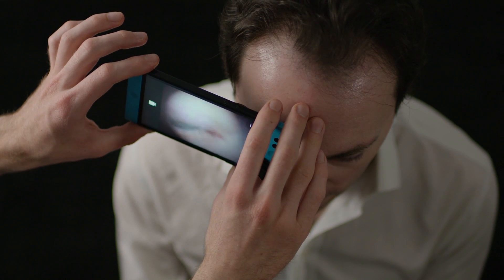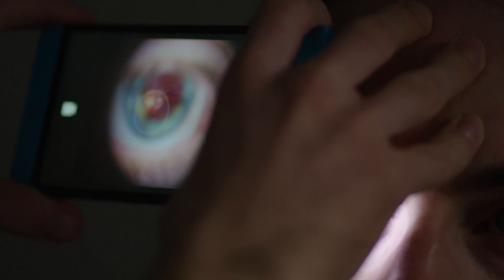From about 5cm, the retina should start to come into view. Get as close as you can, within 1cm, to get the best field of view. Pan from side to side to view different areas of the retina.